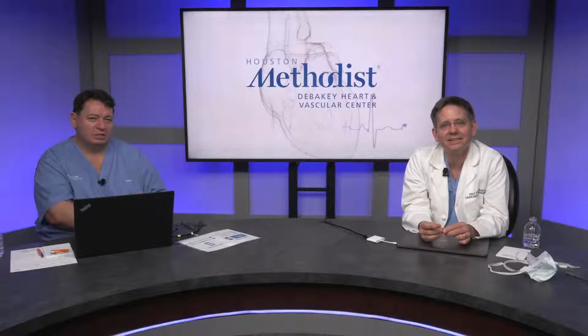And I know I said it's the last question, but I just have to ask one more, because you're on the spot, and this is what I really wanted to know. Do you have any tips for what we do when we are scanning a graft? So you do a graft when you don't have a fistula. I run into some issues where sometimes you do not see flow through the graft. Do you have any guidance on where to do surveillance for the graft, so we make sure we don't make the mistake of saying, oh, there's no flow in the graft, when it doesn't mean there's no flow in the graft?